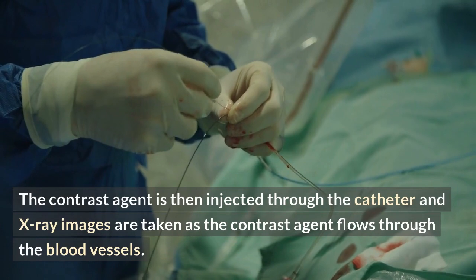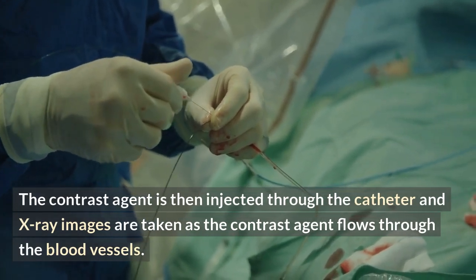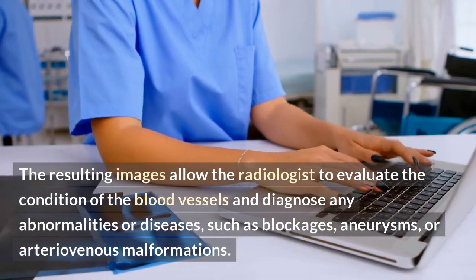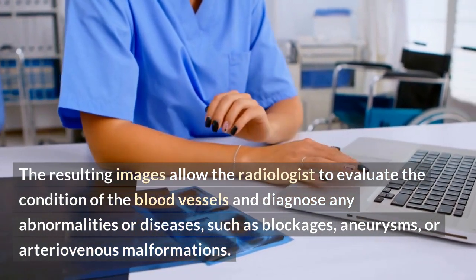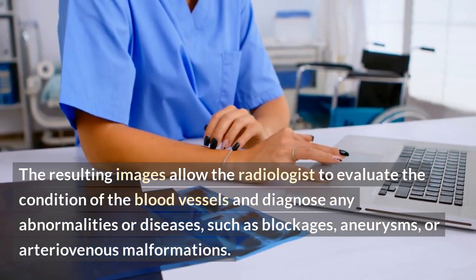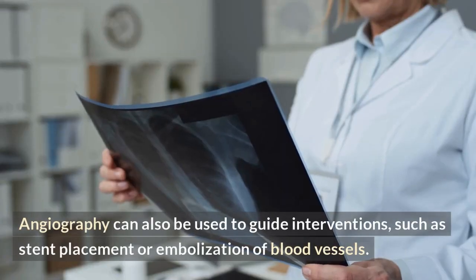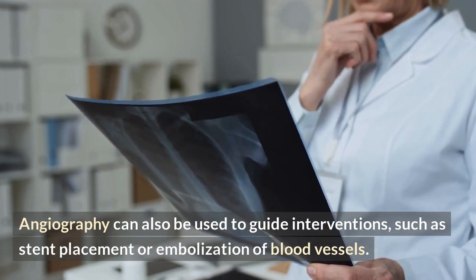The contrast agent is then injected through the catheter and X-ray images are taken as the contrast agent flows through the blood vessels. The resulting images allow the radiologist to evaluate the condition of the blood vessels and diagnose any abnormalities or diseases, such as blockages, aneurysms, or arteriovenous malformations. Angiography can also be used to guide interventions, such as stent placement or embolization of blood vessels.